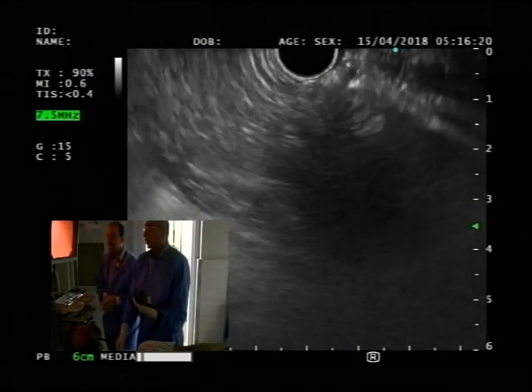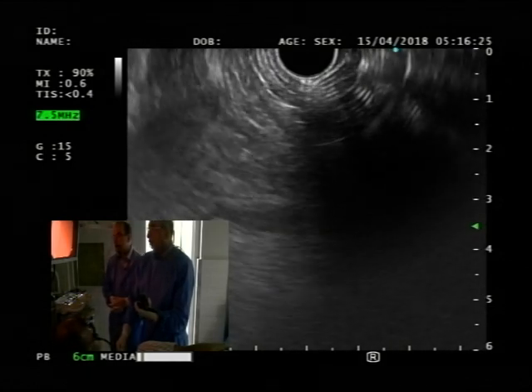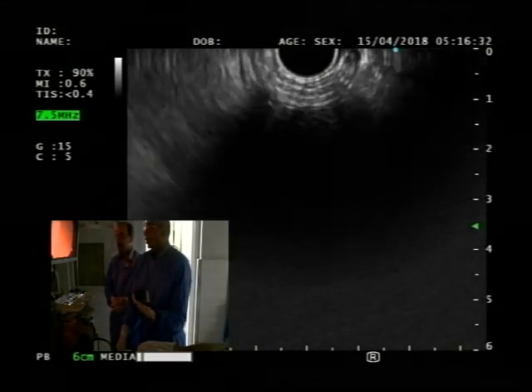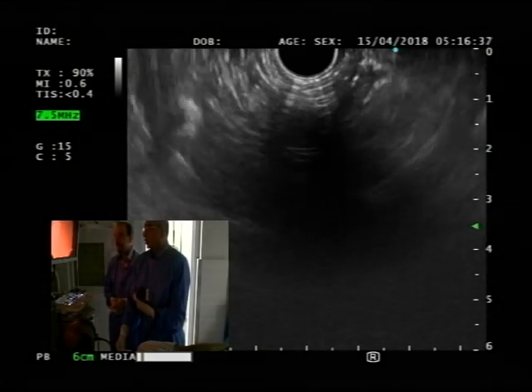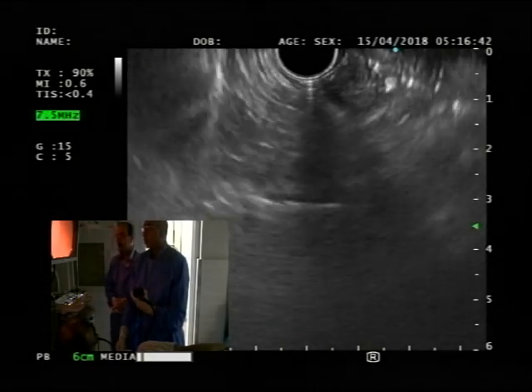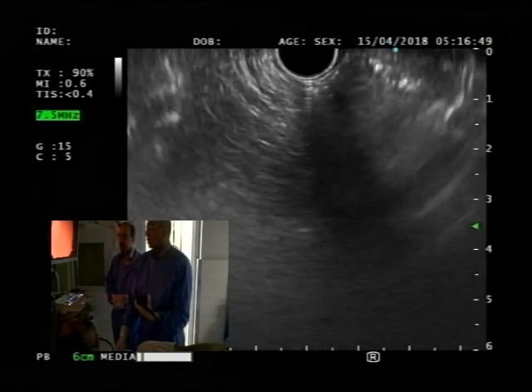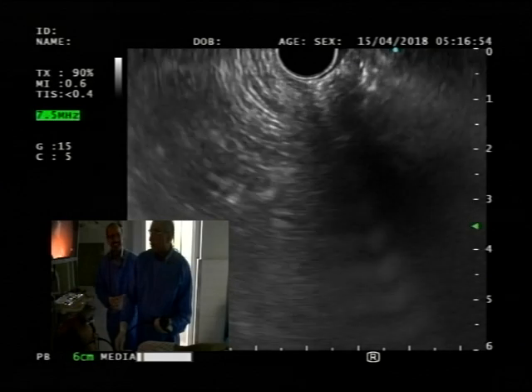We actually, Mustafa, it's Saad. Yes. We have our technicians and ourselves do this evaluation ourselves. And what we are basically looking for is, I know you guys have your cytopaths and they give you the diagnosis almost instantly. Yes. But what we are really interested in is just seeing whether we've got adequate material or not. For that, it's a very short learning curve, and anybody and everybody can, I'm sure, do it. Things that I hated when I was in medical college looking at slides, I kind of enjoy them now.